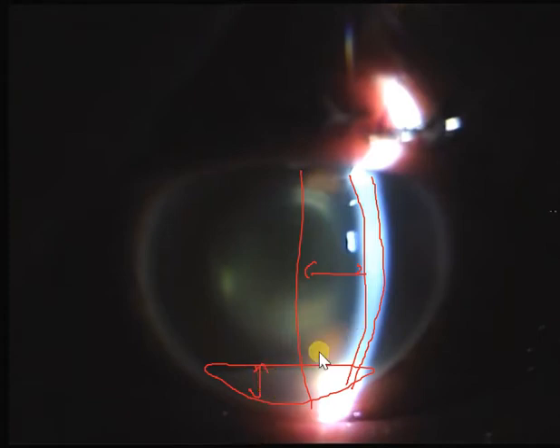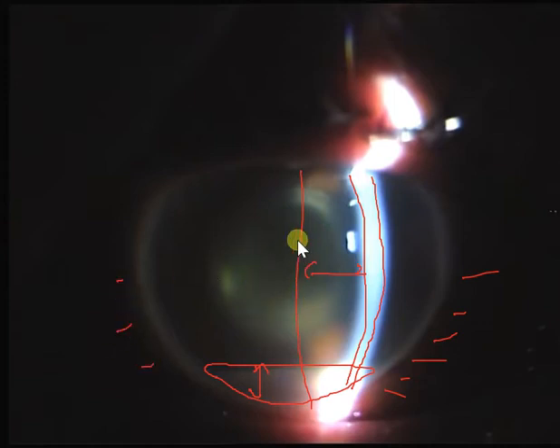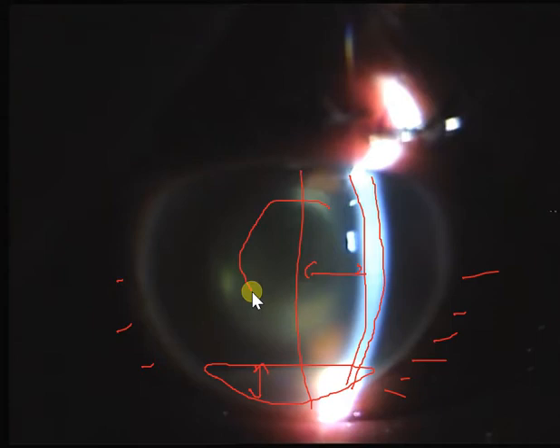You measure the height of the hypopyon — it's about three millimeters. You use the beam, make it vertically shorter, and align with this whitish level inferiorly, then you can measure the height. In the surrounding area you'll see ciliary congestion; there is lid edema; the cornea seems to be hazy; the anterior chamber view seems to be hazy. You will also look for any cells. You can see the opening in the anterior capsule and this is the IOL seen in the mid-dilated pupil.